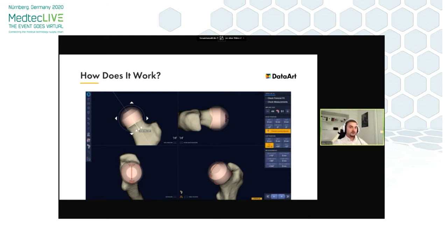This usually forces the user to pick a larger implant pair size or push the implant closer to the femoral neck. Also, as implants are tied together, the acetabular cup is moving along with the head virtually, so you can check its position in a different mode. That's a very quick and brief showcase of how it might work.